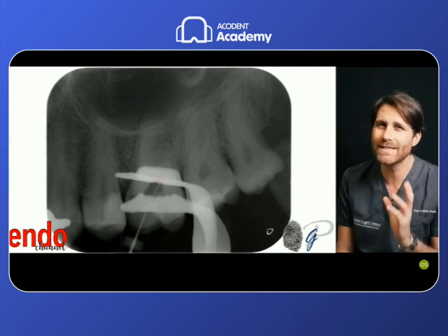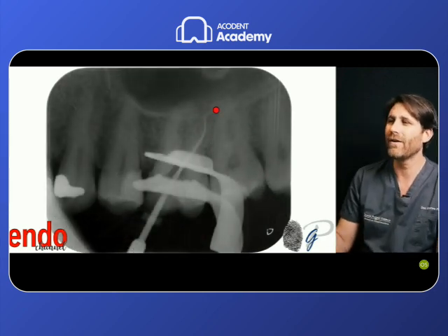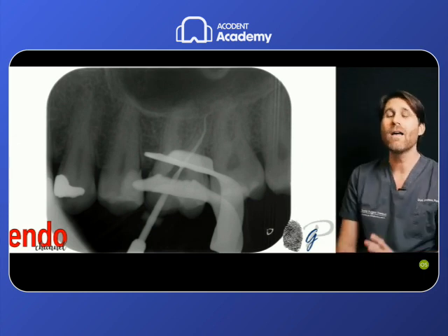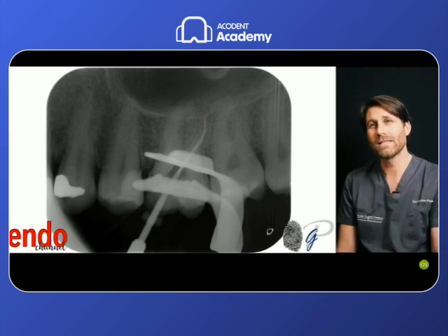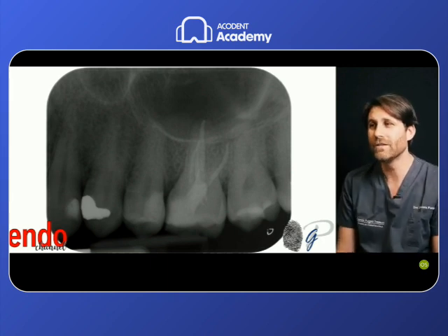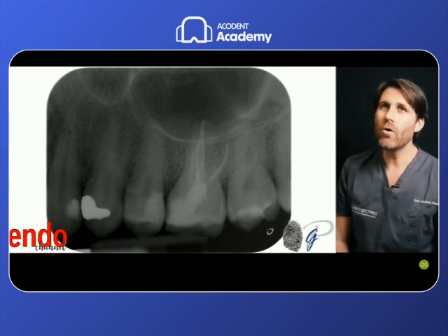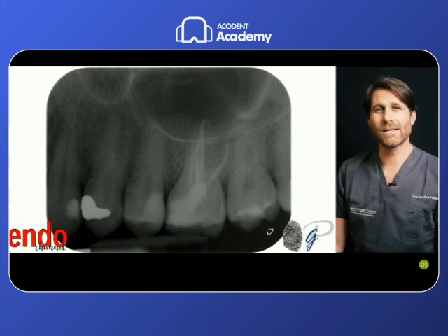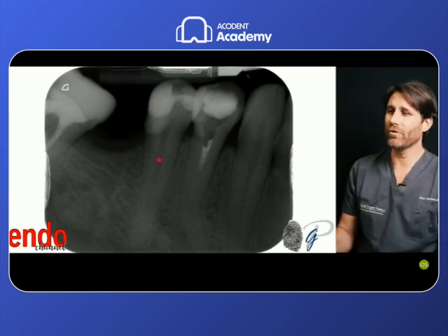So I do not insist in these cases with the hand file, and we can use the Reciproc Blue 25 to follow this double curvature to scout this apical third where a manual file was not able to do it, just pushing and going away, as I will show you later. And this is the final radiograph of this treatment performed by this technique. So in these cases, we know that this technique can be helpful not only for the coronal scouting, but also for the apical scouting. And it can be helpful also in the retreatment for the apical scouting.